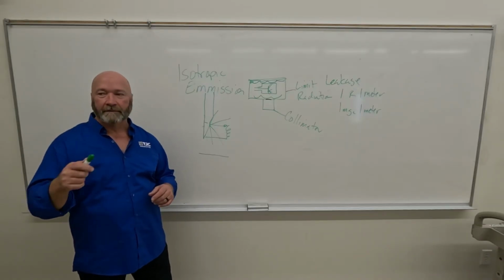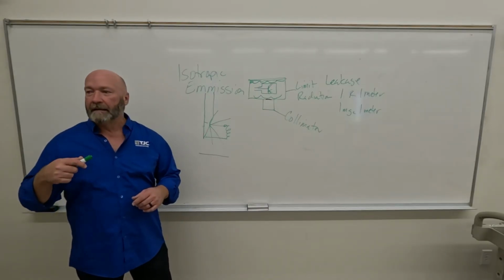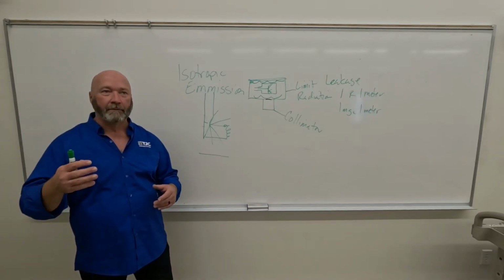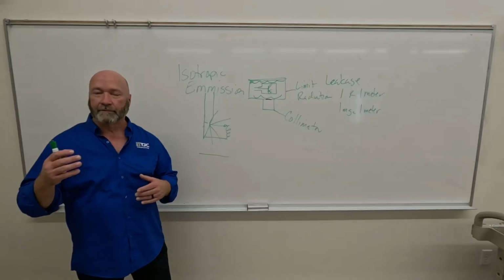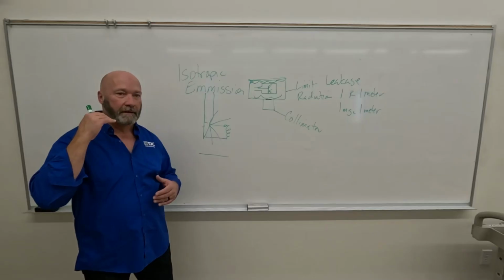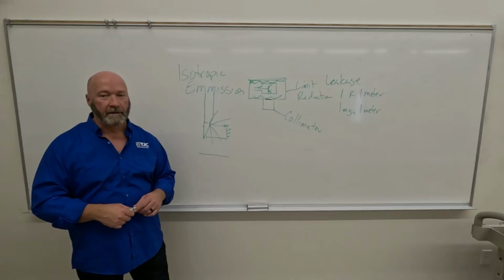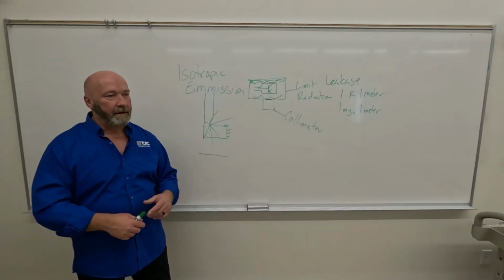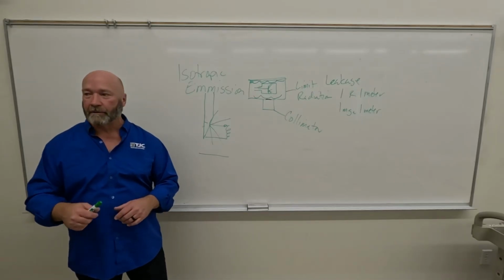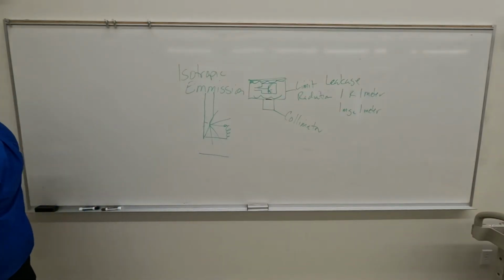Generally, if your rectifiers fail, you can diagnose that because your index number would indicate that your exposures are exactly half of what they should have been. So you're going from direct current to alternating current across your X-ray tube. Okay, so again, file that away. Consistently half: if all your exposures drop to half of what they should have been, your rectifiers aren't working. So you pull on rectifiers.